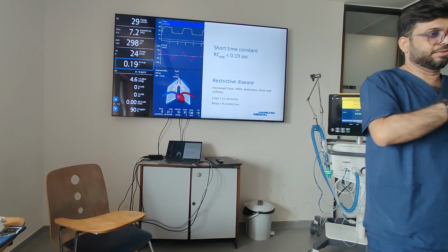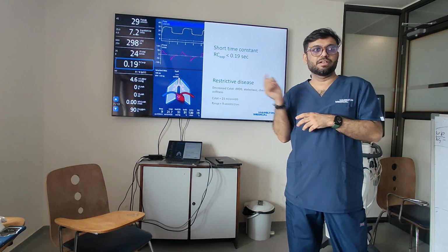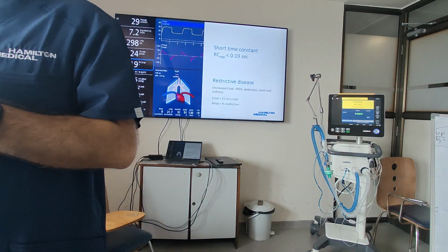From then on, the permissive hypercapnia. Yes, that is the IntelliVent. I'll show you that, after that it will come. Sir read it this morning, the minute volume. Sir told me 10 and 8.